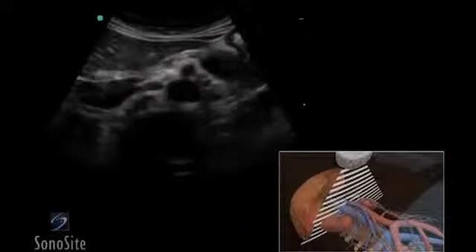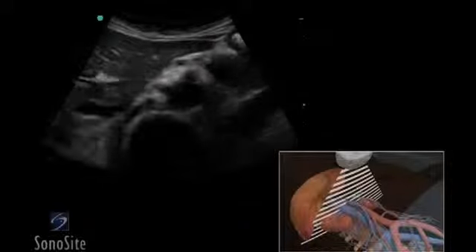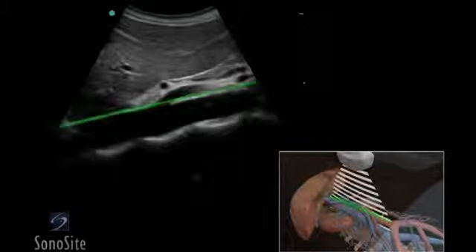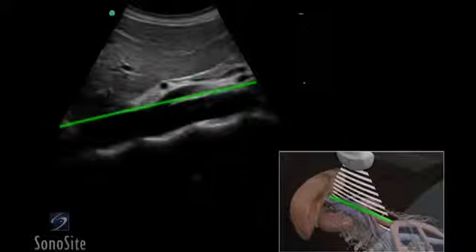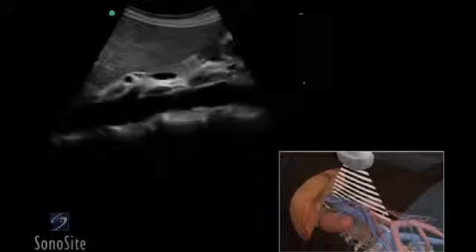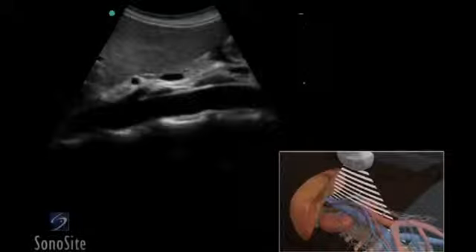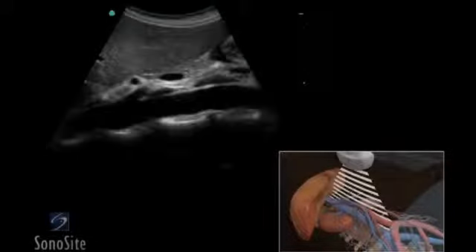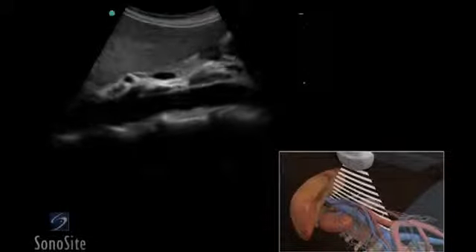The transducer is returned to the epigastric area and rotated 90 degrees clockwise with the orientation marker to the patient's head. The transducer is swept side to side to identify the maximal diameter of the aorta.